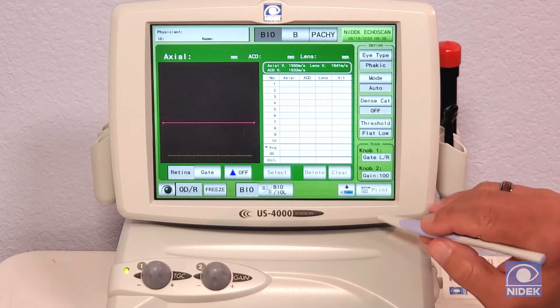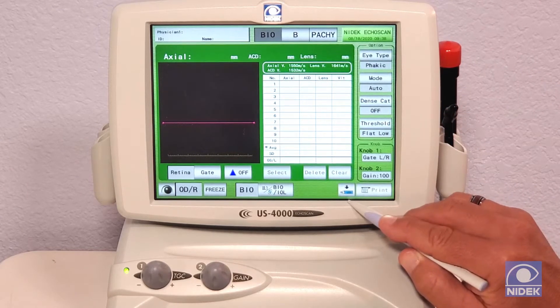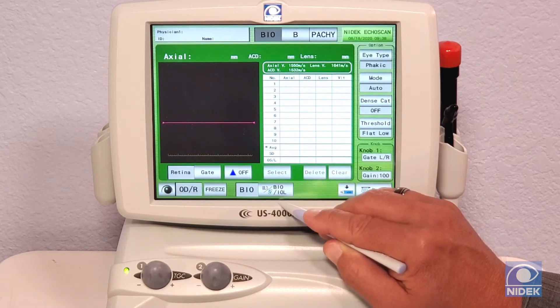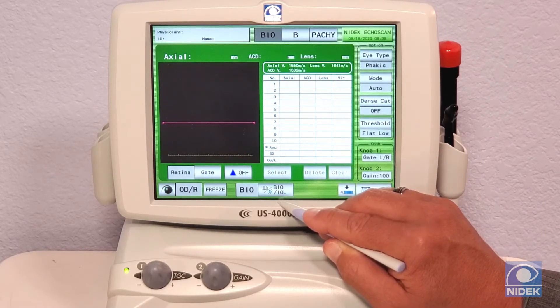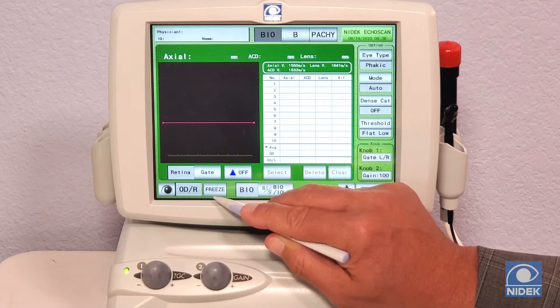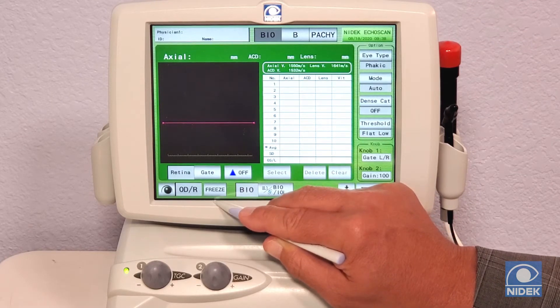Down here we have our print option. You can also save to your USB. This is the biometry to IOL button for your IOL calculations. And this is your live screen.